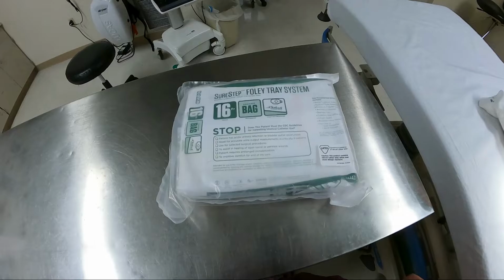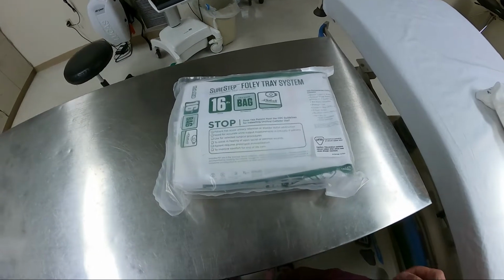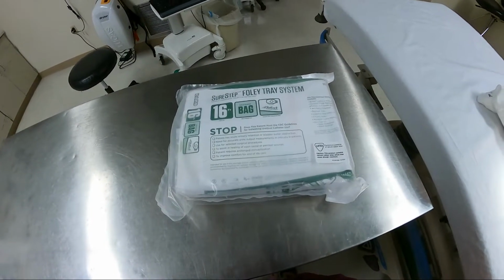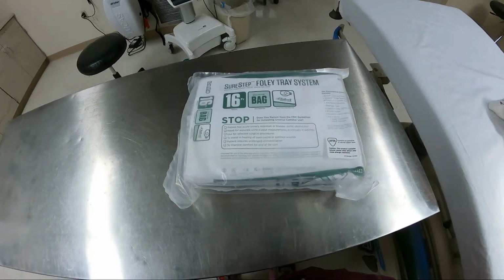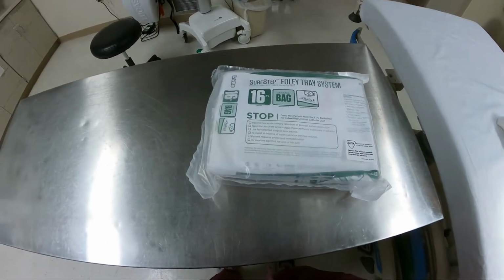And in Meditech, you will find a check sheet of sorts that you can put in there the reason why you're putting in a urinary catheter, because no longer is "the doctor said so" a good enough reason for putting a catheter in.